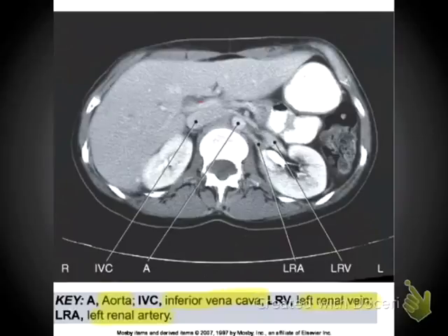But the renal artery, if you're doing a CTA, will always be the vessel that's really highlighted going into the kidneys. Based on this, as we can see, we actually have iodinated contrast going through the kidneys, coming out the ureters, and so perhaps this is not the best scan to be looking at because it gets everything confused because we have contrast returning through the venous system.